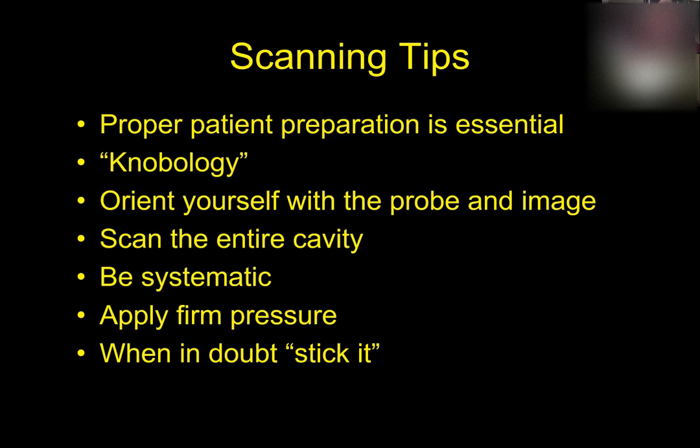That's the way I started doing ultrasounds when I was a resident, and that's the way I continue to do it. My recommendation to you is figure out what is your right way to do it, and then get in the habit of doing it that way every time.